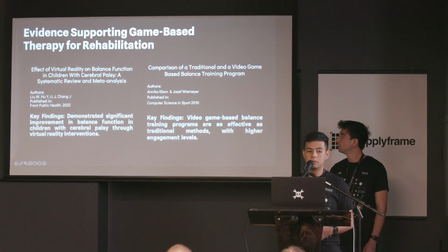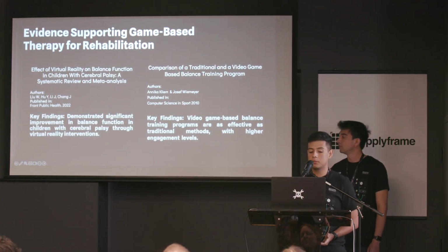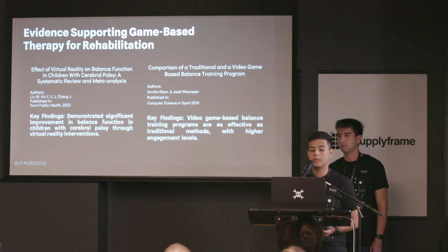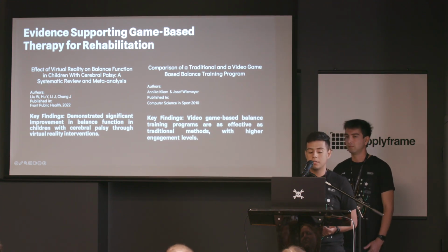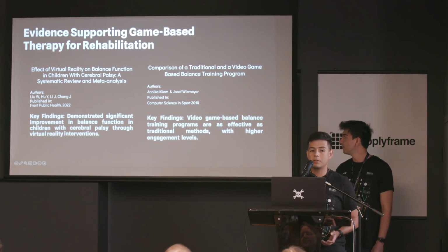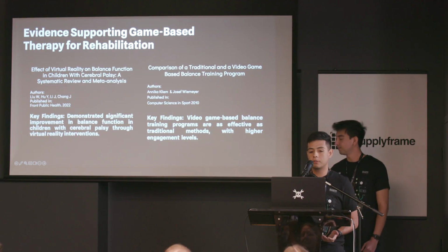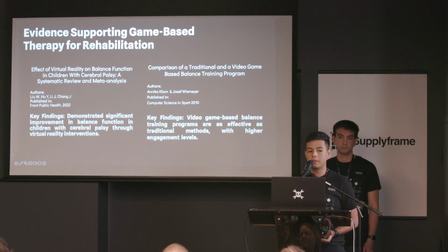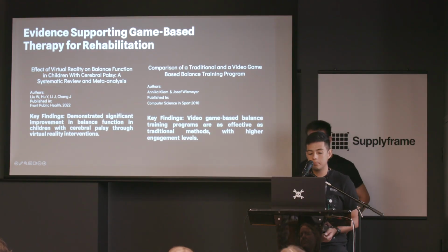So we started to search for some type of solution that other authors have studied in the past, and we found that particularly game-based therapy is a really interesting way to solve these problems. The authors say that this type of therapy is as good as the traditional one, but gives you more engagement for the little ones and gives you another way in order to develop those tasks.